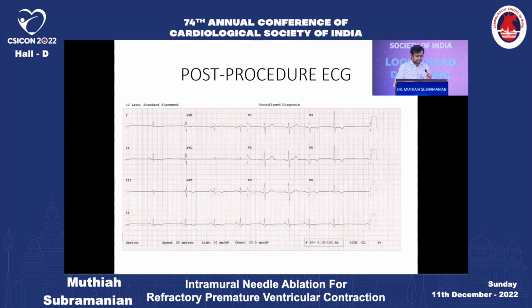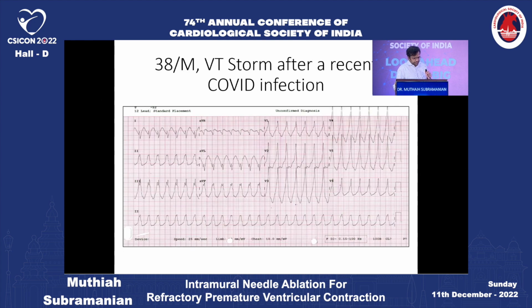So this was the post-procedure ECG. Going through your coronary veins is a good option in some patients where you have a mid-myocardial substrate, provided they have a venous anatomy that is suitable and that you are satisfied with mapping in the veins to find an early enough signal.